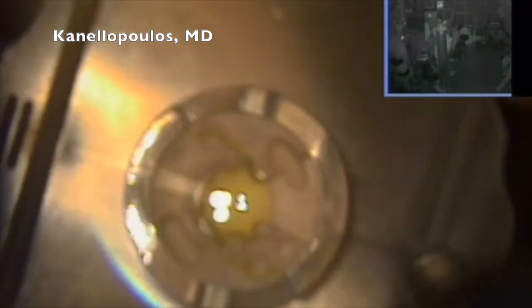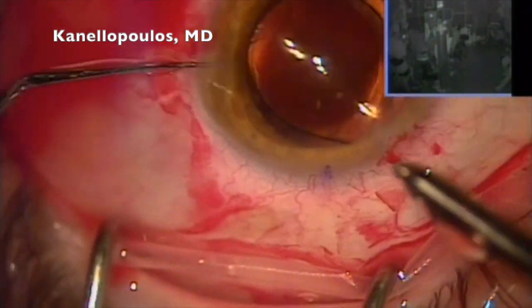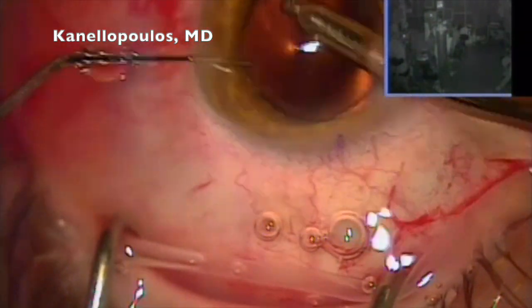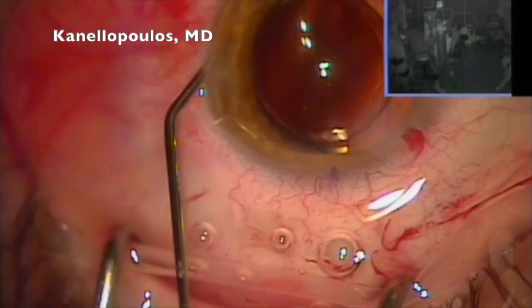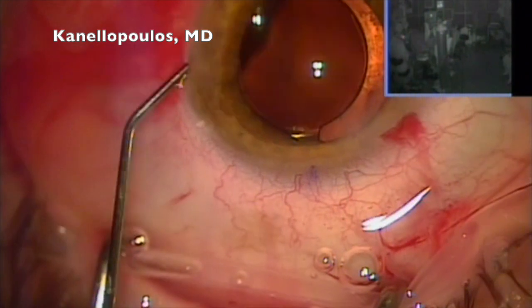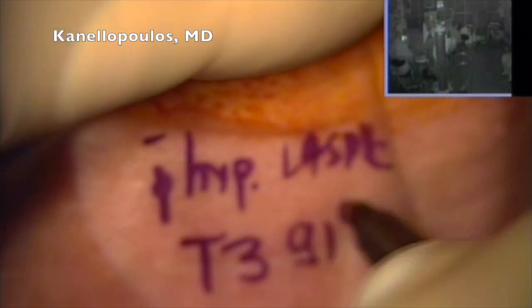We're using a toric intraocular lens, fold the lens, and I still do all these steps myself manually. Want to make sure everything's as good as possible. I'll go under the lens, clear any debris and the residual viscoat, and over the lens, very careful in removing most of the viscoelastic, and now come in and center the lens, hydrate the incisions, and we have a very nice case. Patient feels comfortable, wants to do the other eye, will jump directly to the right eye as well. I'm recentering here.